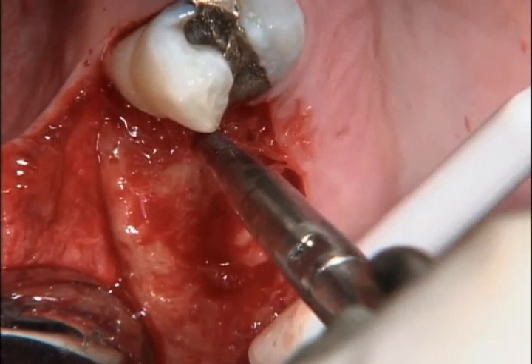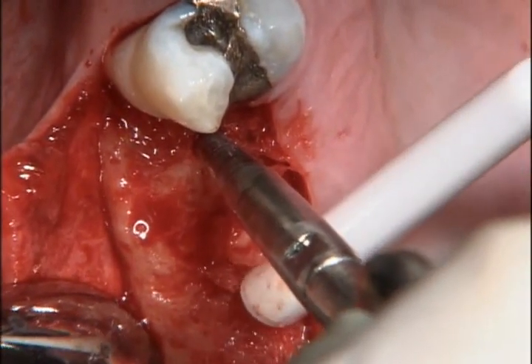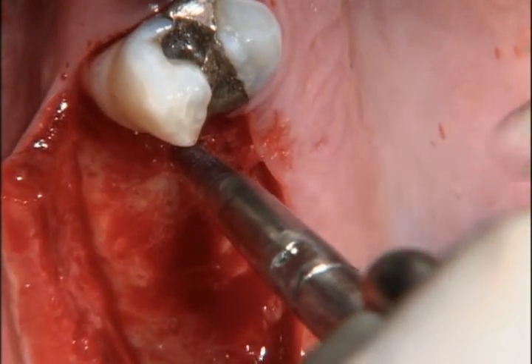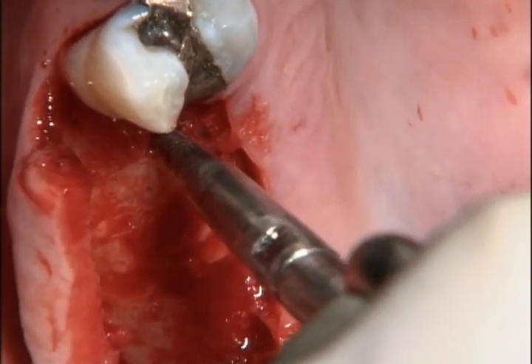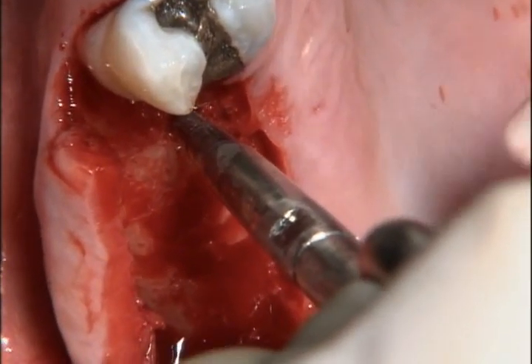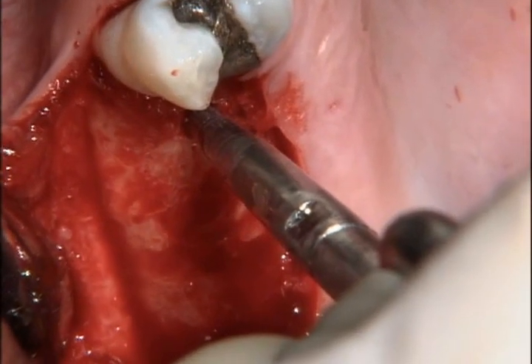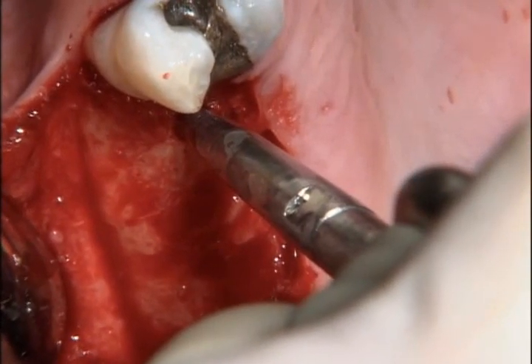The smallest diameter, or number 1 osteotome tip, is connected to an osteotome handle and used to test the bone quality in the first implant site. It's placed into the site, previously marked by the round burr, taking great care to position it with the correct orientation for eventual implant placement. The surgical mallet is then used to tap gently on the end of the osteotome handle. In primarily cancellous bone, the cutting edge of the osteotome tip will advance easily at a rate of approximately 1/2 millimeter or more per tap of the mallet.